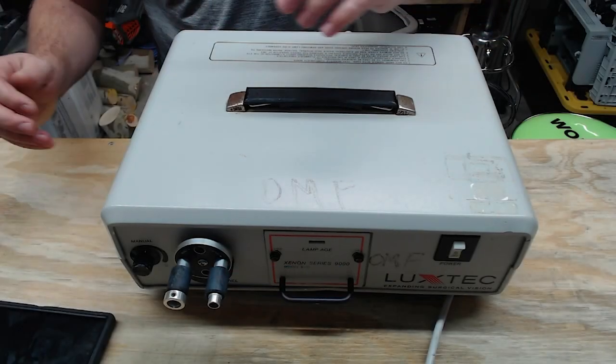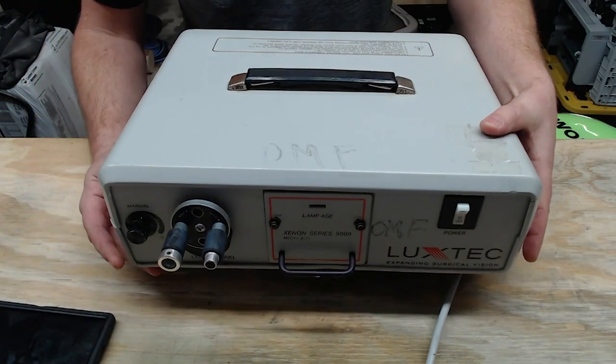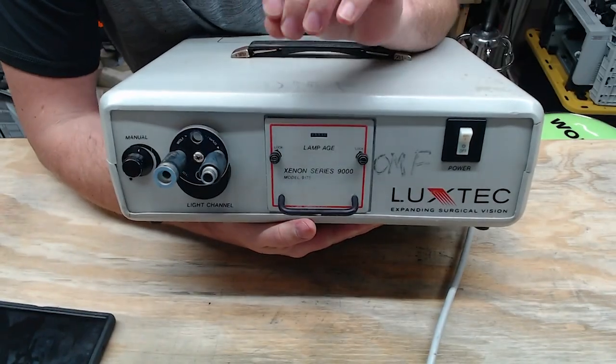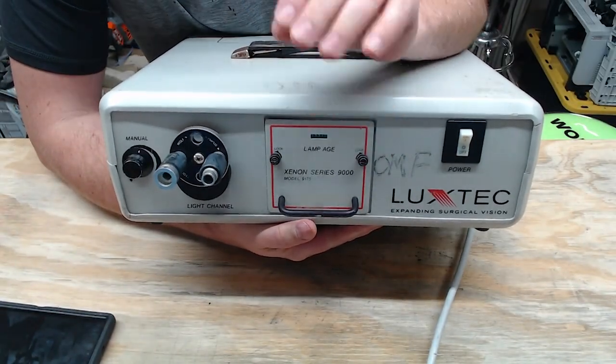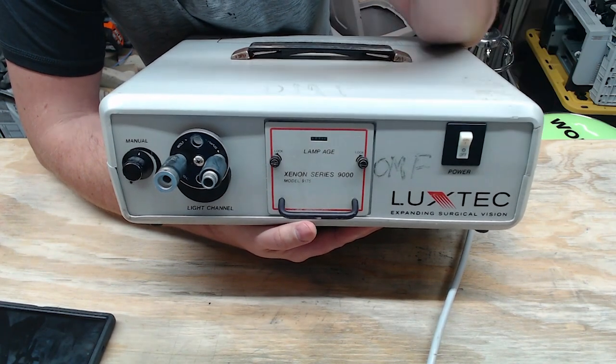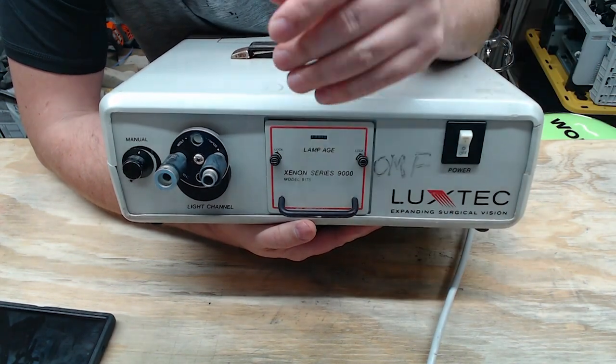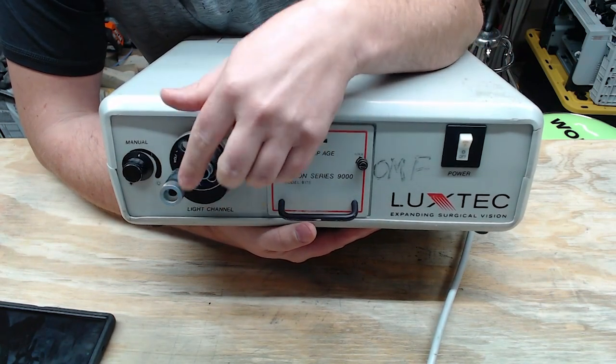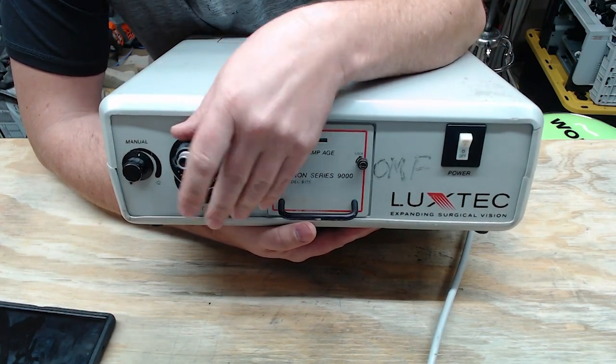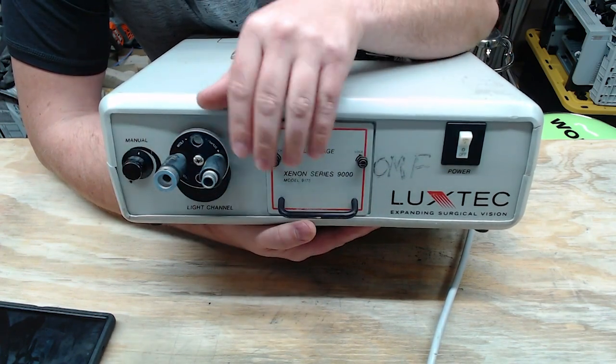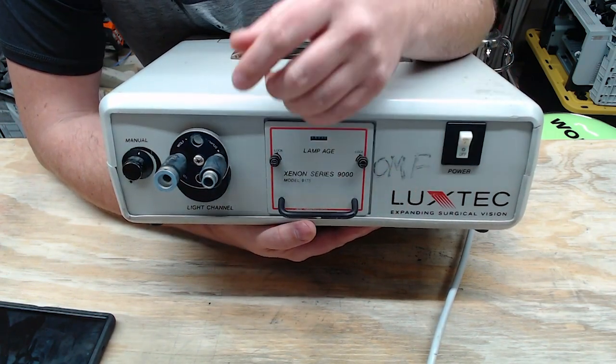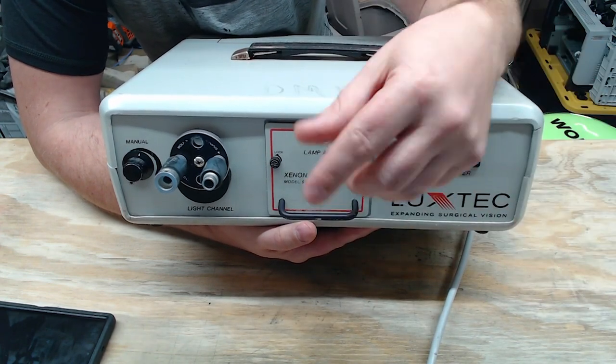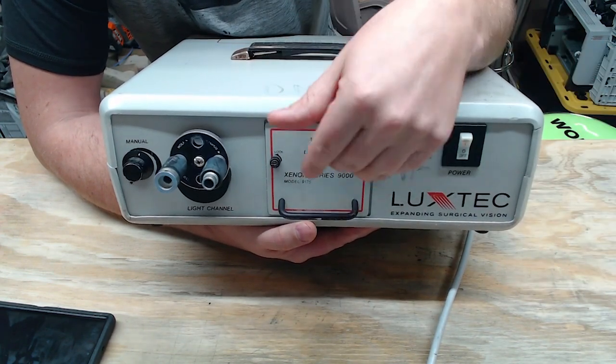Alright guys, what we have here is a Xenon Light Source, and this is a device that's designed to give out very high intense light for doctors so that they can carry out surgical procedures. Now, a light source connects a light cord right here using the turret, which accommodates various diameters and formats of light cords, to a laparoscopic system or a doctor's headlight so he can see what he's doing.